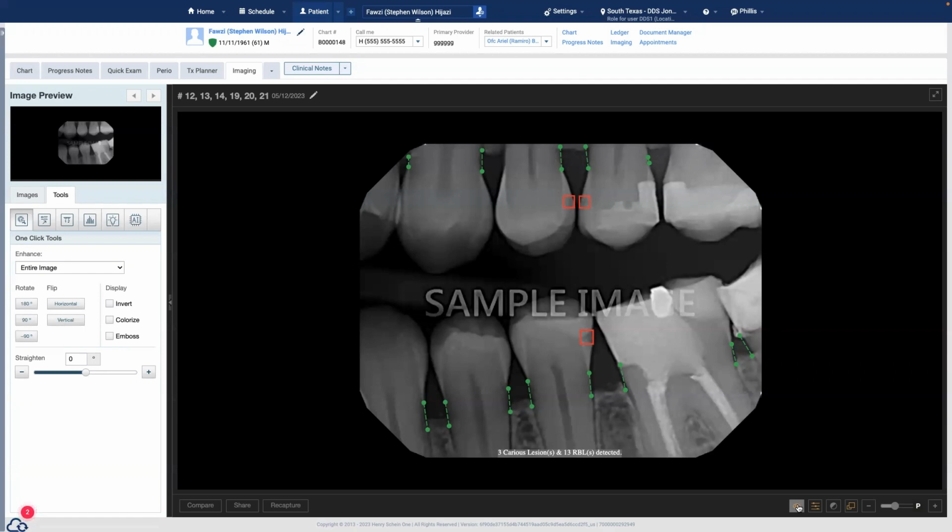There are some, like caries detection, where I think there's a general agreement at this point that you need to have FDA clearance in order to call yourself a true caries detection AI. So yeah, there are some companies out there that do not go through FDA clearance for all of their indications.